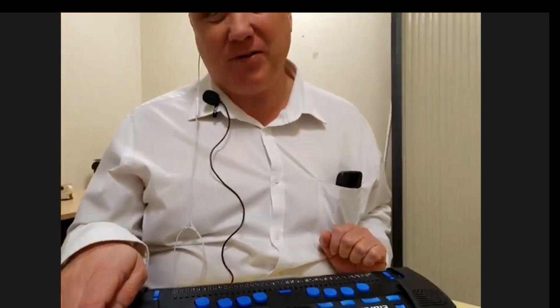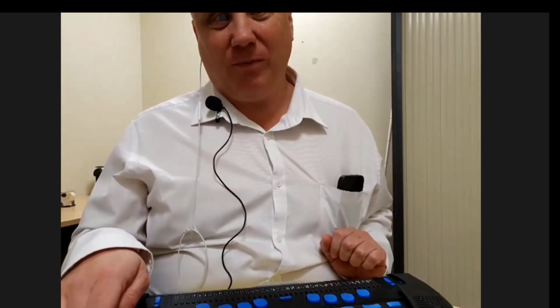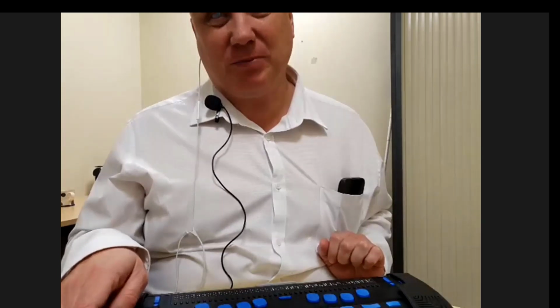So if you've got a work laptop, for example, you can plug that into the Elbraille and use the Focus 40 without having to separate the Braille display from the Elbraille. We also have a headphone jack on the right-hand side.